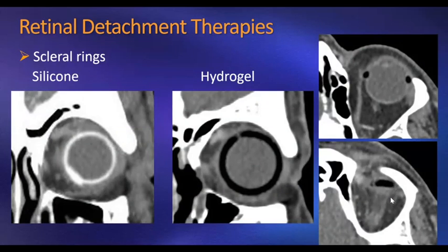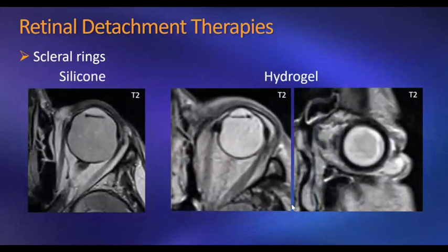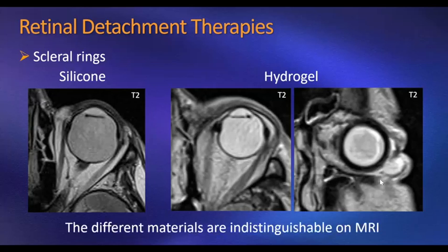superior and inferior orbit. On MRI, these two are indistinguishable from each other, and often they will not be even visible or clearly visible to the reader unless the radiologist notices the deformity of the globe. Only occasionally the entire ring will be captured in the coronal plane.